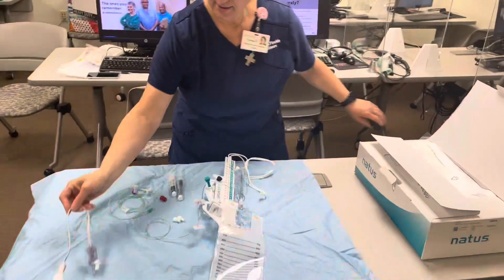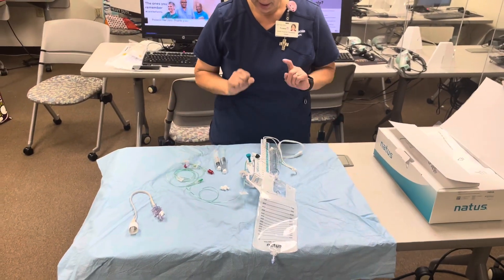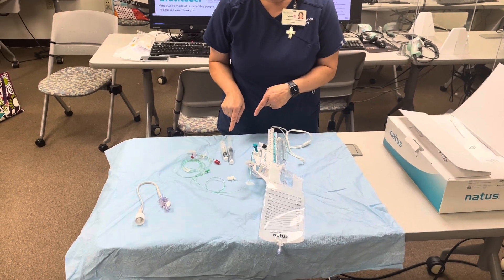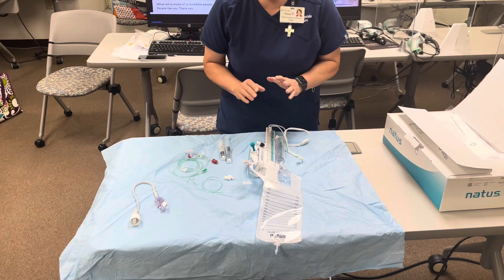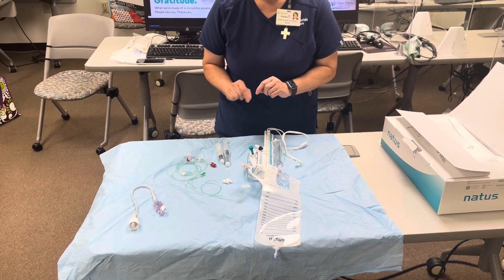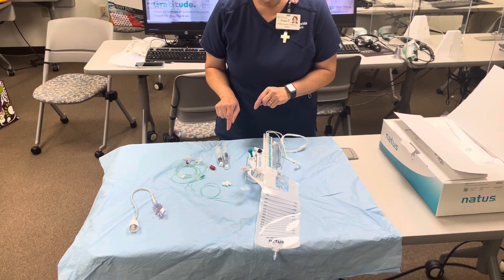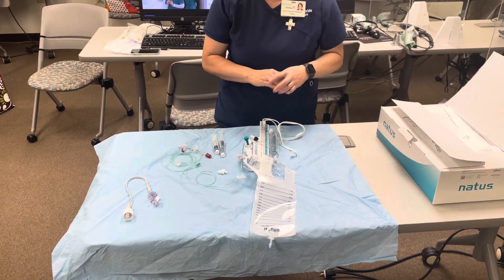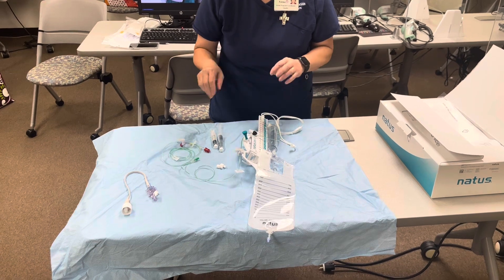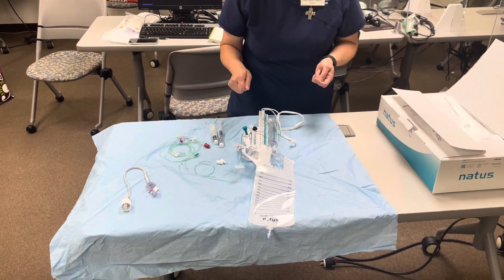I have my transducer here and my normal saline flushes — you need two, and they have to be preservative-free. When you open the normal saline flush, it is not sterile packaging, so you can lay the part out or someone can assist you opening it up. Make sure you use aseptic technique.